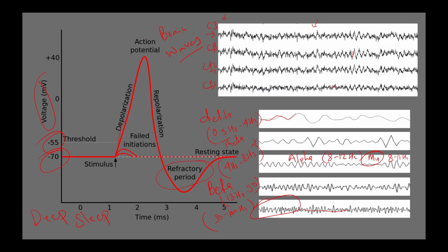Due to this ability to monitor in real time different states of consciousness and cognitive engagement, EEG is an invaluable tool for researchers studying perception and all those things.